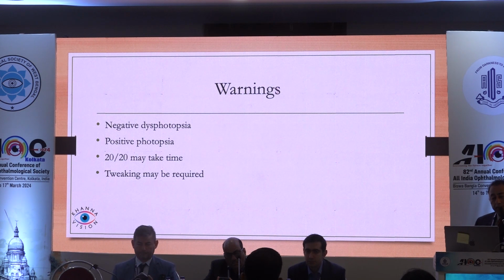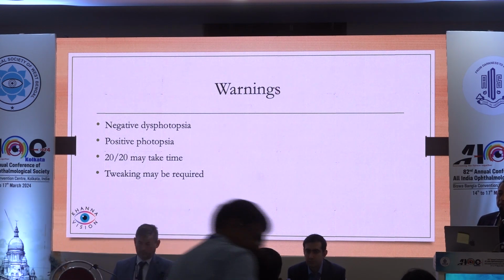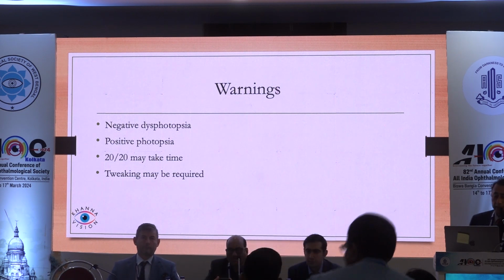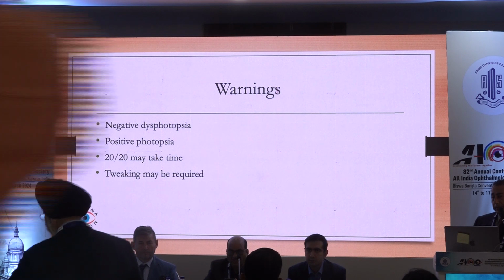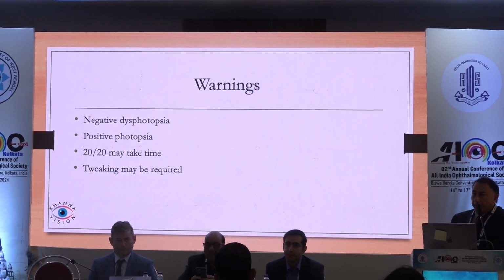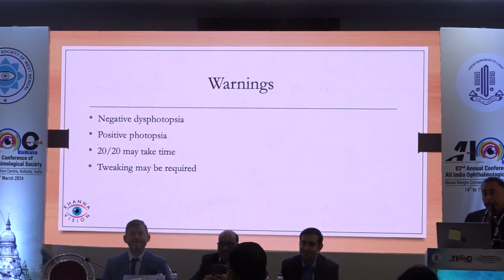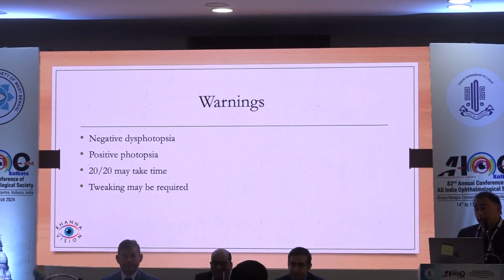Positive dysphotopsia, or glare and halos, occur more often. Negative usually disappears by 4 to 6 weeks. But glare and halos, mostly they disappear by 3 months, but some 5-10% remain till 1 year. At least 2% in my practice have gone on to 2 years.